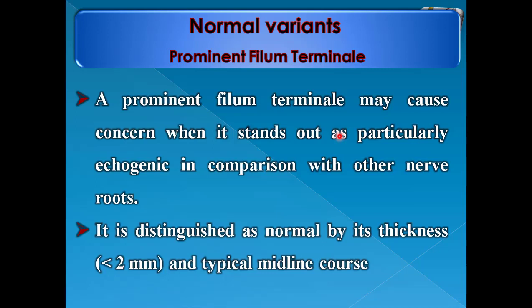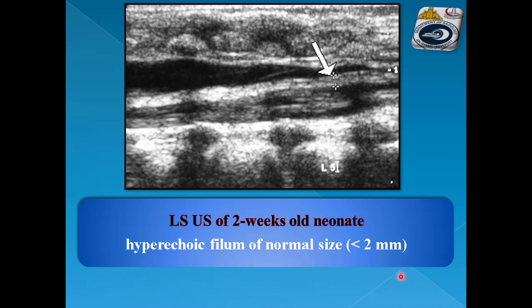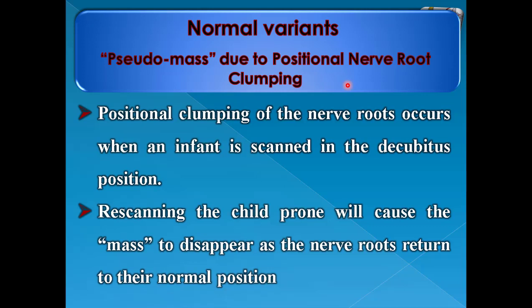Prominent filum terminale: a prominent filum terminal may cause concern when it stands out as particularly echogenic in comparison with other nerve roots. It is distinguished as normal by its thickness being less than 2 millimeters and typical midline course. This is a prominent filum terminale still within the normal range, being less than 2 millimeters in diameter, shown by LS ultrasound.